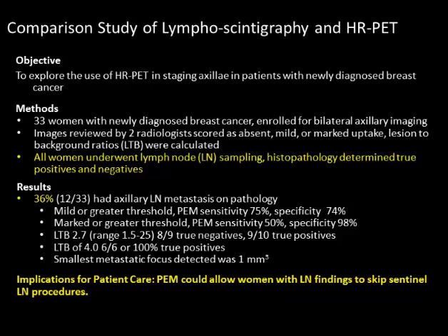You can see here that she could vary both the sensitivity and the specificity depending on where she set her threshold, because she was just really trying to determine what is the true sensitivity. But I think the remarkable thing here is you can set your sensitivity so that you can either very easily with 100% accuracy detect 3 and 4 millimeter metastatic lesions, which is considered macrometastatic disease to the lymph nodes, or you can even set it to detect micrometastatic disease, 1 cubic millimeter of metastatic cancer in a single lymph node, and still be able to pick it up. So you can decide. I know some centers are actually doing axillary dissections only in macrometastatic disease, not micro, and they're using radiation therapy for micrometastatic cancer. So as the trends are moving forward, you actually get to decide how you want to use this information.